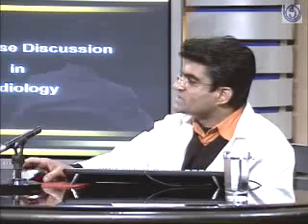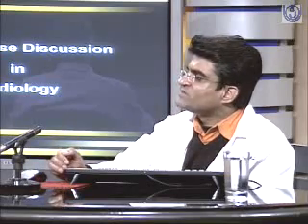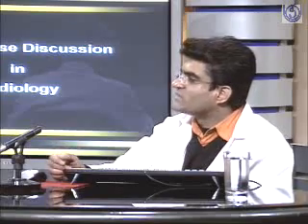I would like to know one more thing. You told me underexposed, overexposed, right? The voltage amount has to be the same for the barium swallow as for the scout film. Is it the same, or does there have to be some difference? There is a slight difference, because you are giving an opacified column of barium which can absorb more X-rays. So you have to slightly increase the penetration. When you increase the penetration, you increase the kV.